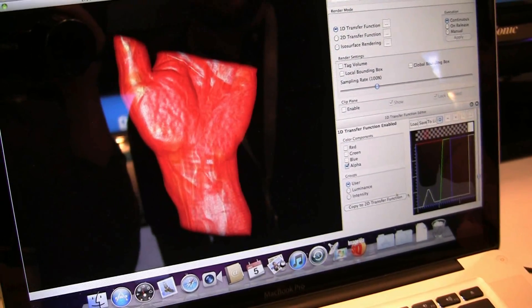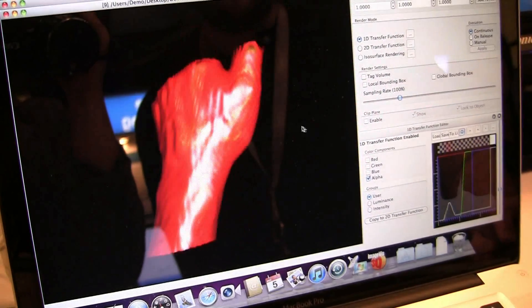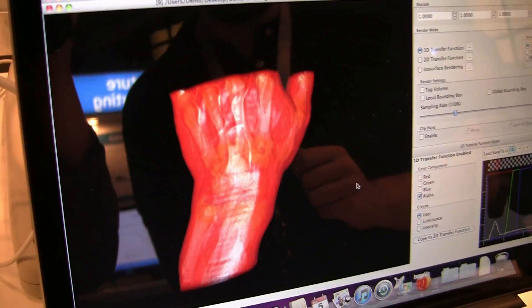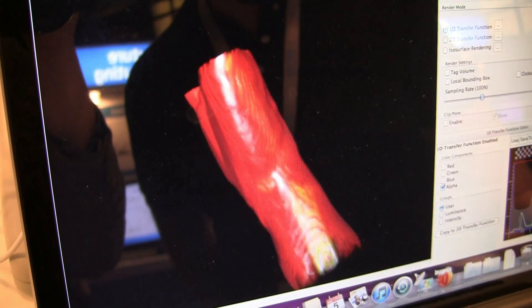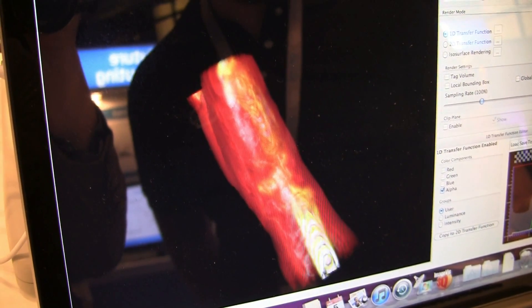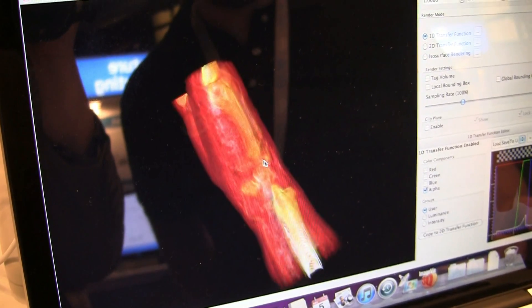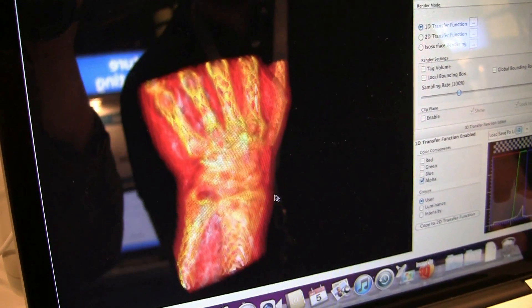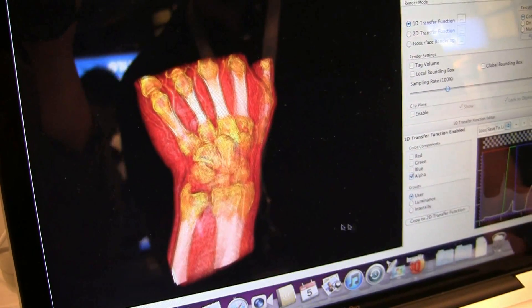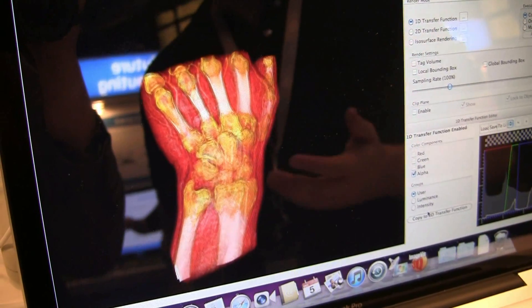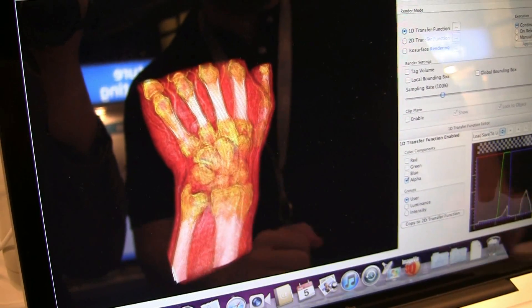Wow, so there goes the skin — that's amazing! Yeah, exactly. Here we don't see any of the bones anymore. If there should be any skin-relevant issues we want to see, then we can do that here. And let me change it one more time to something a little bit different. Now we see again much more of the bone structure, a little bit of the flesh here. Pretty much whatever the doctor wants to see from this medical set, we can easily change those settings with the mouse.